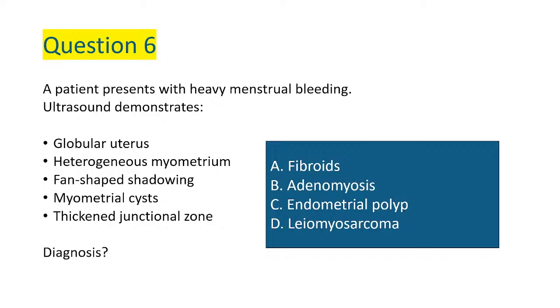What are we looking at? What shadowing means, the pregnant characteristics. People can see this is now a real ultrasound. Hear me, people, radiologists, the clever sonographers, the competent radiographers, let's gather here. What are we doing?